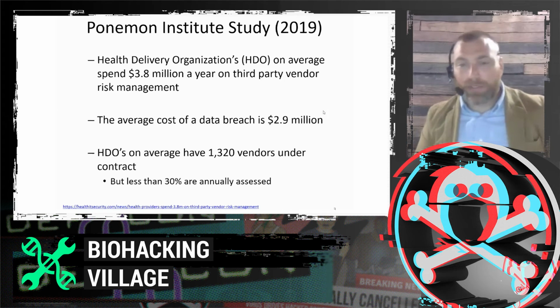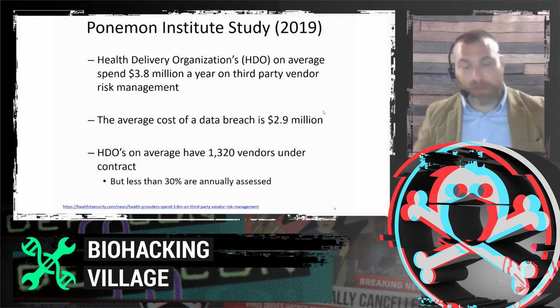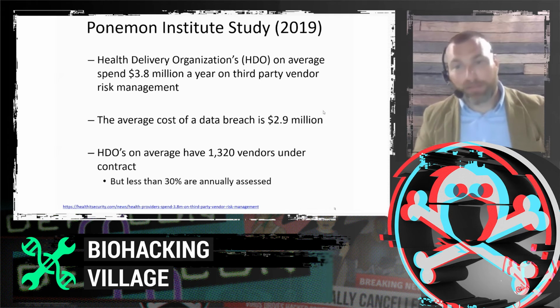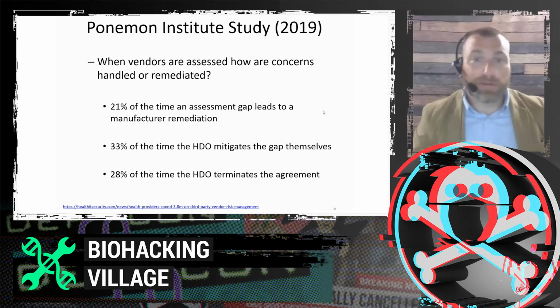They tend to do a really good job assessing all of those third parties initially, when they're first looking at them. But less than 30% are actually reassessed annually. So it's a big lift and a good amount of work to get them assessed initially, but we're not really re-looking at these technologies a year, 2 years, 5 years after they're in the door.